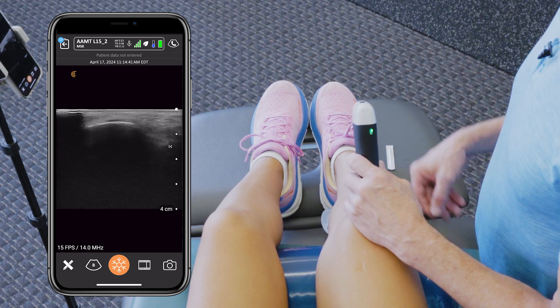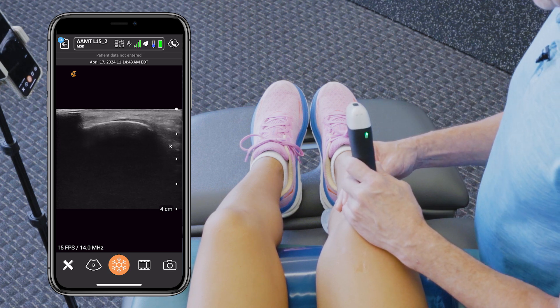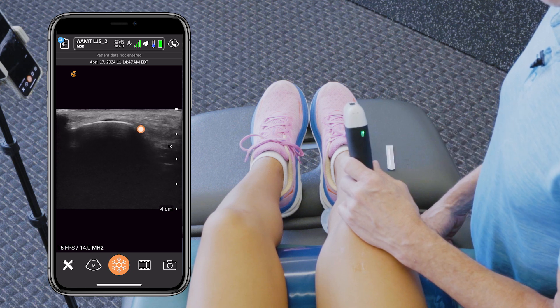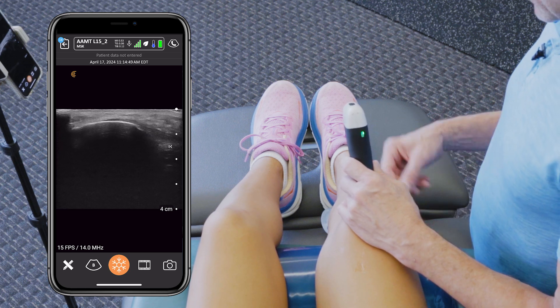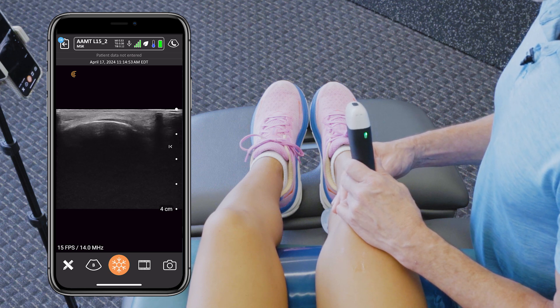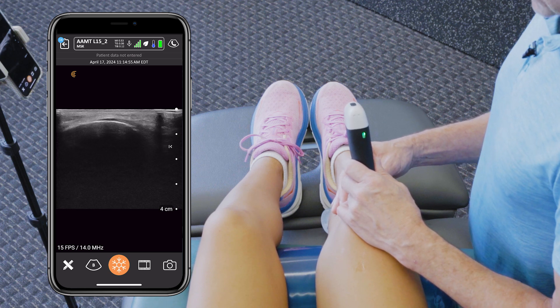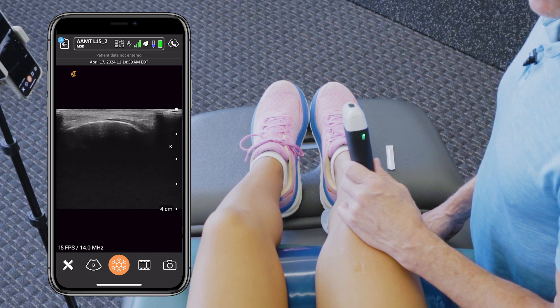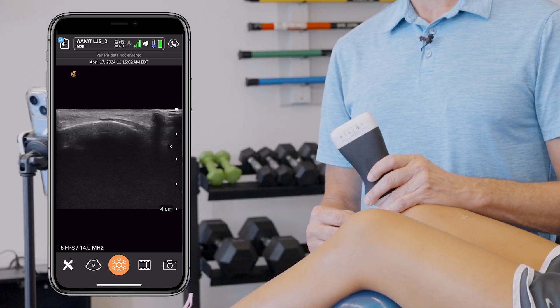Once we get that view, we will look for the enthesis of the patella tendon at the inferior pole of the patella. Then we're going to take our dry needle and enter from distal to proximal, at a very shallow angle — probably less than 30 degrees — to try and make bony contact at the enthesis.